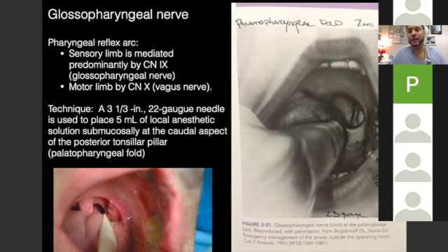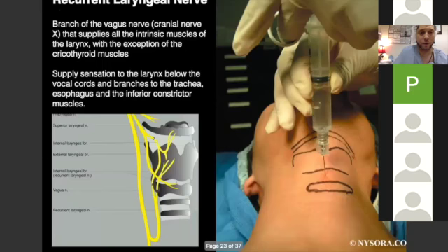This is an injection technique, so it doesn't have to work mucosally. So you would not use 4% here, because that will just use up part of your aliquot of what you're allowed to use without getting any benefit over 2%. So 1 or 2% lidocaine at the palatoglossal arch will allow you to accept the laryngoscopy and also prevent gagging as the scope is going in the mouth.